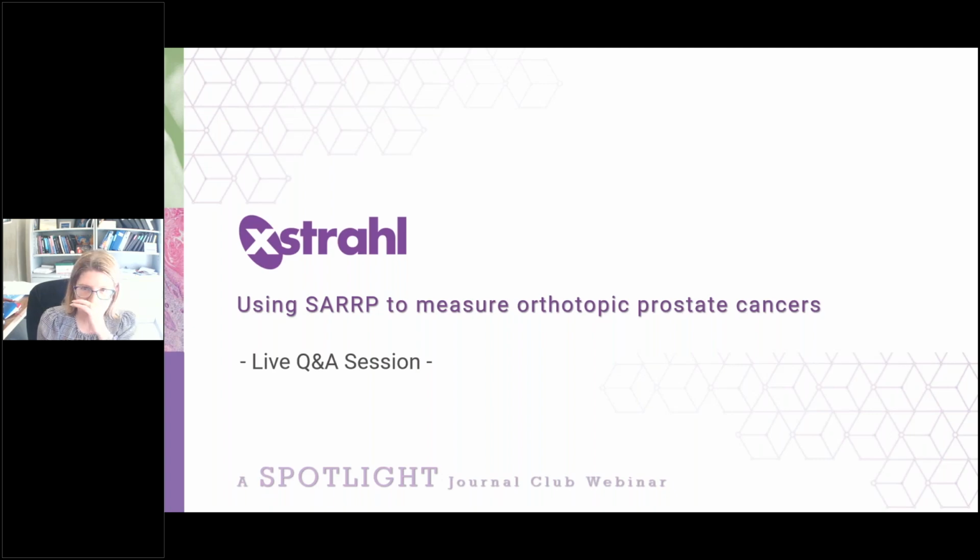Because I guess you could maybe take that same image and then redo the contrast so that you can see it better in the second animal, and then do your measurements that way. So you may be able to speed it up a little bit that way. We have not done that. We've only used a single bed, and we've just done the CT imaging that way. So that's something that you could try and see if it would work. I don't know.